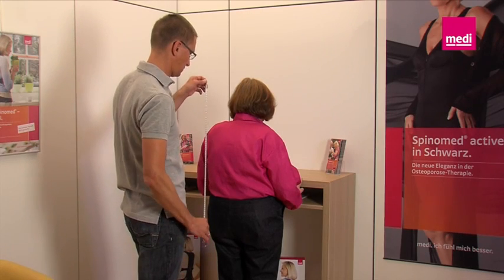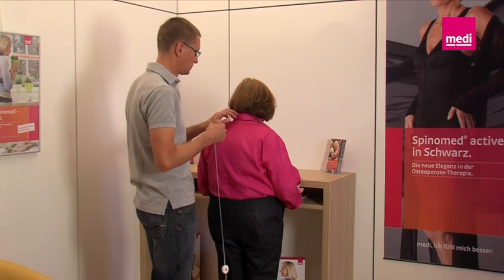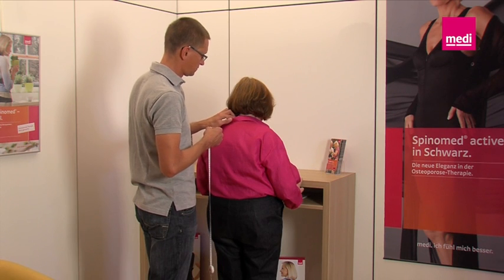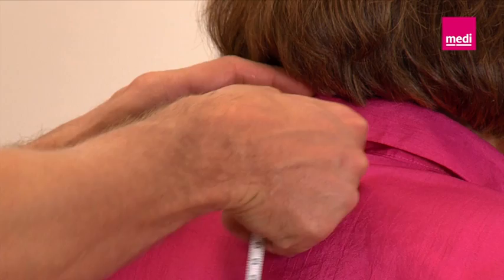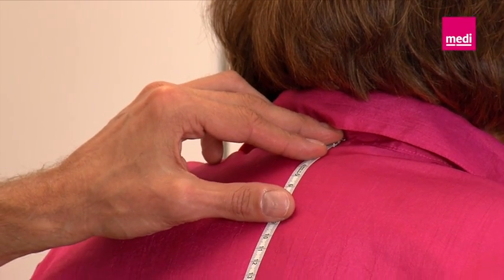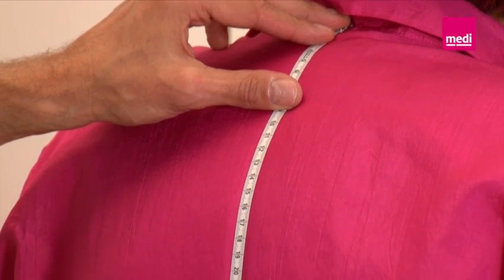Measuring. To select the specific size of the SpinoMed spinal brace, first determine the length of the back splint. Palpate the C7 cervical vertebra and, starting from it, measure over the entire spine to the sacrum.